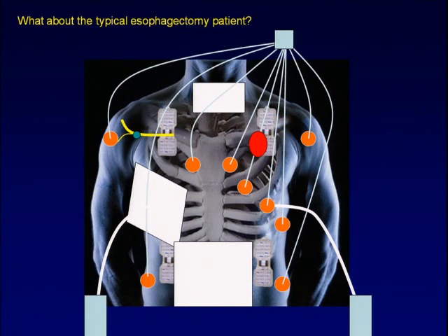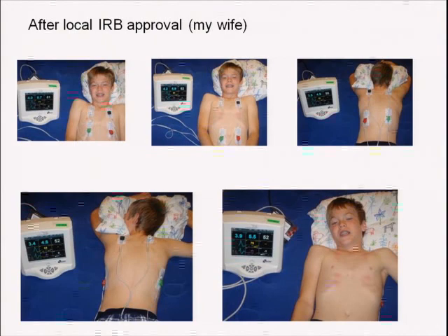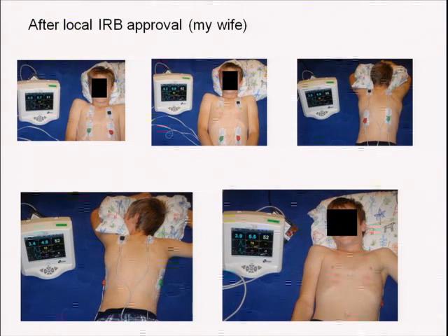Okay, well, maybe the device seems to work, but I don't know how in this perioperative environment it's really going to behave for us. So after approval of the local IRB, my wife, and recruiting a subject who's my son and saying he would be anonymous, we put him down and we put the leads on. He's actually sitting over here today, but we put the leads on in a variety of different arrays, and we looked at what happened. At close, spread out, on the back, spread out, and then flipping them over. And some interesting things came out.